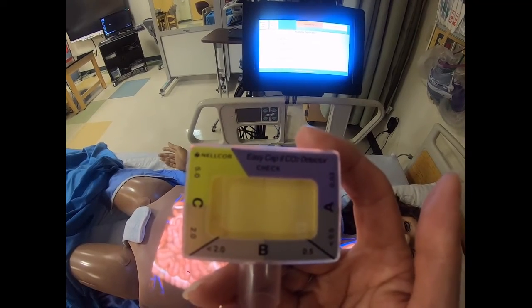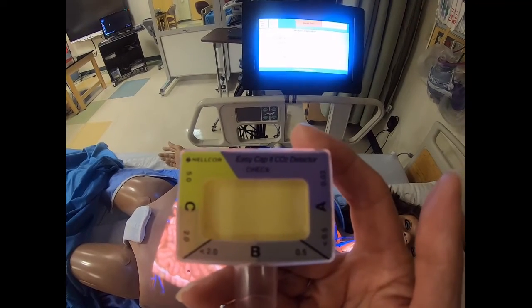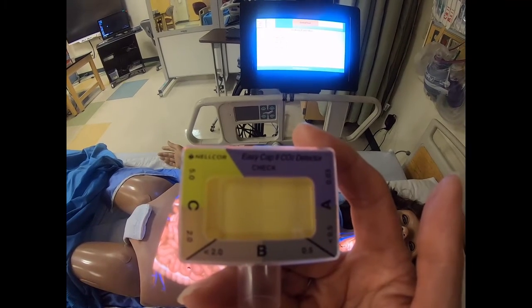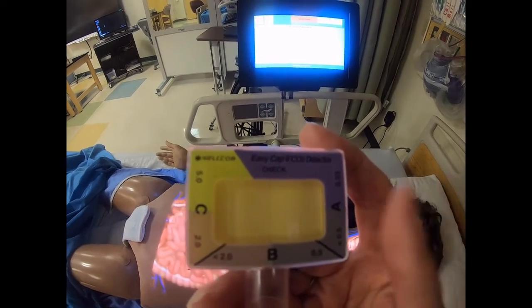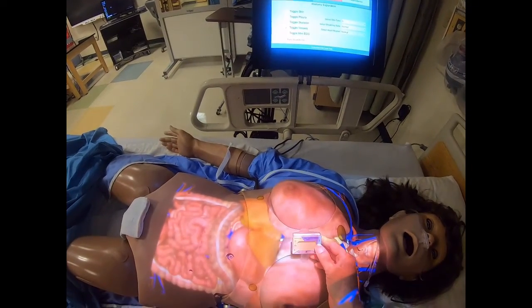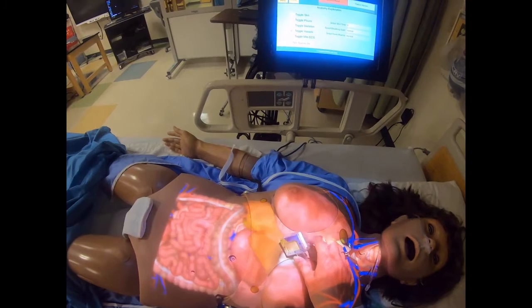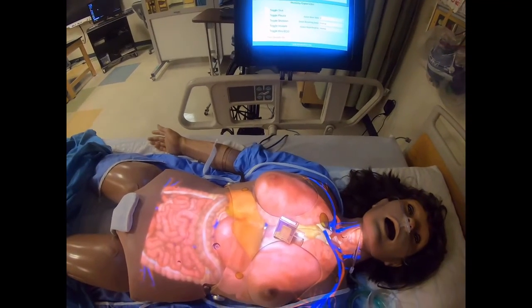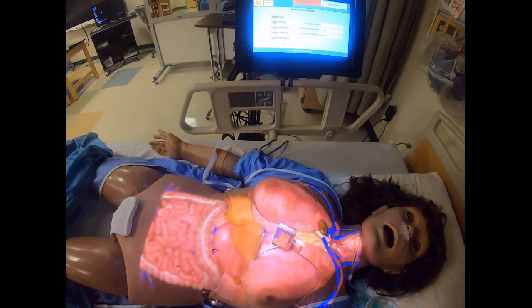Some of the other reasons that we may find that our end-tidal CO2 goes up is drug overdoses. So that's many times why a person has the issues that they do, is that they stop breathing because of whatever drug it is that they have taken.